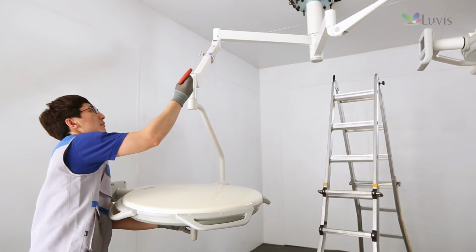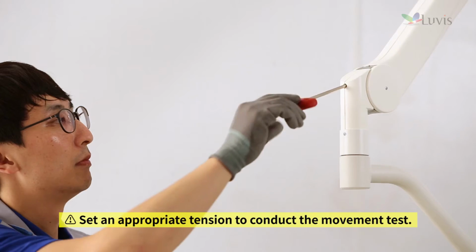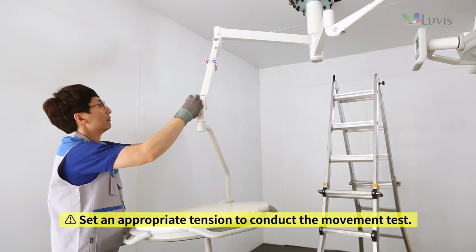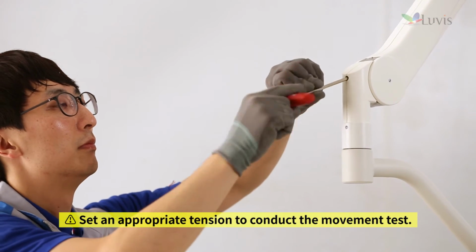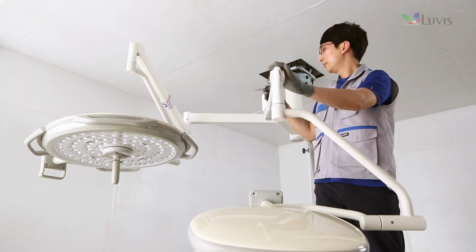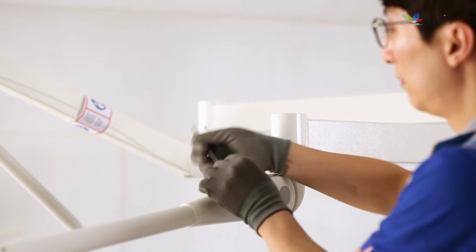Turn the tension arm internal bolt with the M5 hexagon wrench to adjust spring tension. Turn the hexagon wrench clockwise to reduce tension. Turn the hexagon wrench counterclockwise to raise tension. Check the M200 tension arm's tension adjustment location. Remove the fixing holes protection cover.